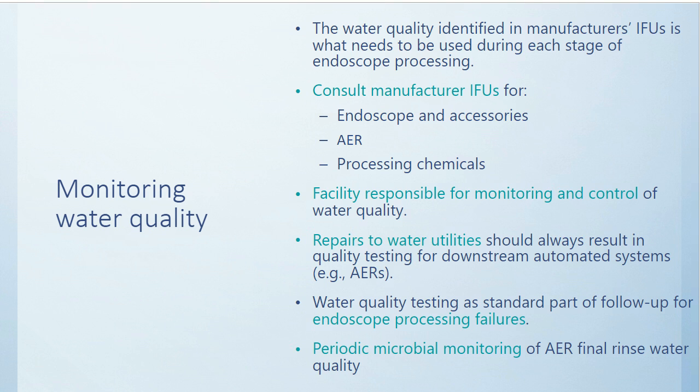So as part of water management plans, there should be periodic microbial assessment of the AER and processing equipment. That should be considered to identify water contaminants or contaminated equipment, which could contribute to recontamination of a device that's already been high-level disinfected. Also, periodic microbial assessment of the water itself that's used for final rinsing should be considered.